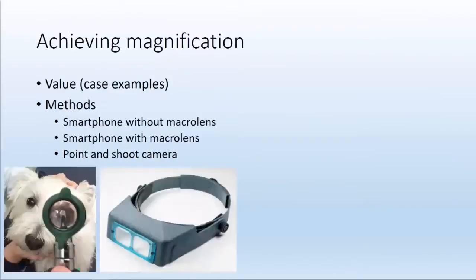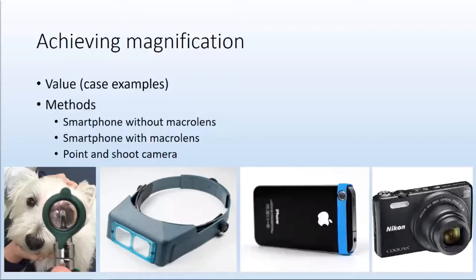So these are the traditional methods that don't help us collaborate, but I heavily encourage them. I tell students and visiting veterinarians that you will not get enough out of your examination unless you magnify all of the structures of the eye. We can't perceive the details that we need to see with our naked eye, and sadly, especially after we turn 40, because then presbyopia settles in and we need bifocals, and you definitely don't have the near vision to accommodate to see it. So we need an optivisor loop or the magnifying glass from the otoscope.